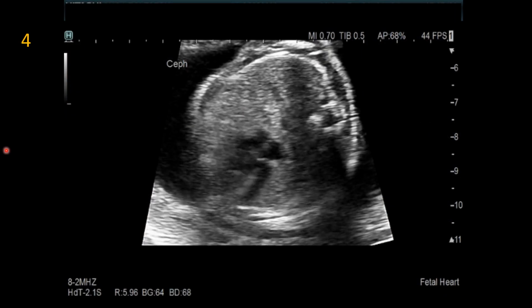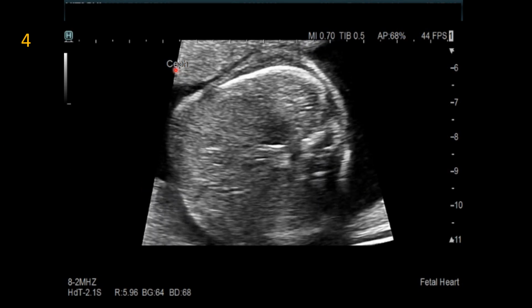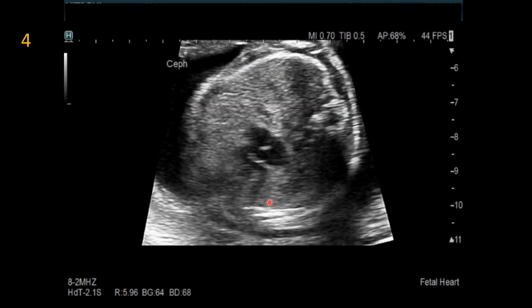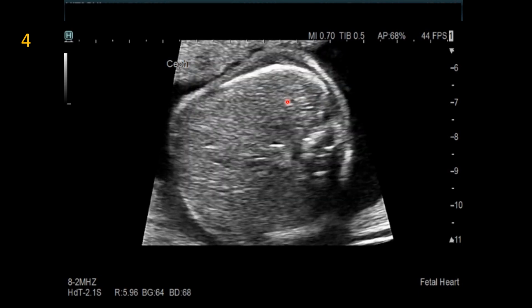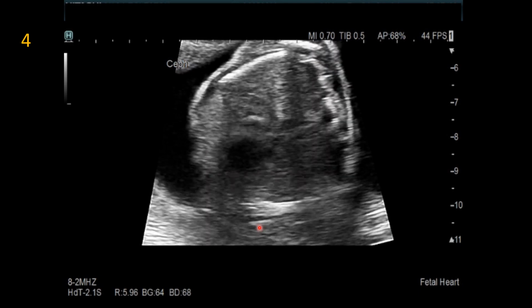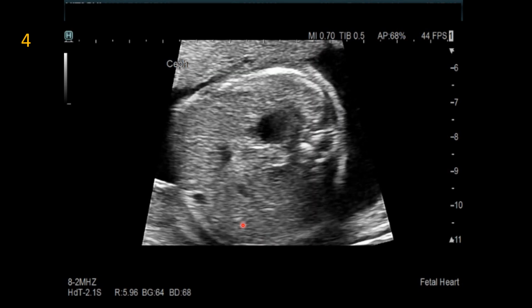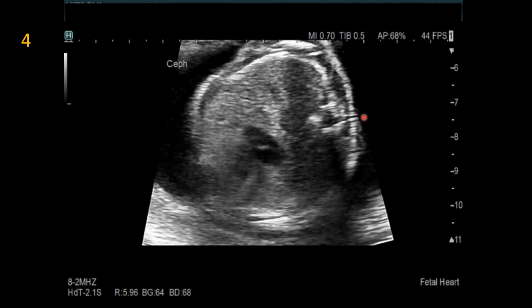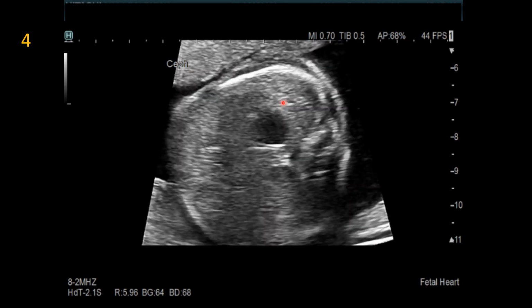Final case of right atrial isomerism. Again, this fetus is in a cephalic presentation. This is a transverse view through the upper thorax down into the diaphragm. So that means the stomach is on the right side. The heart is in the left chest, apex pointed to the left. Here's left, anterior here, posterior, and you see levocardia with a right-sided stomach.